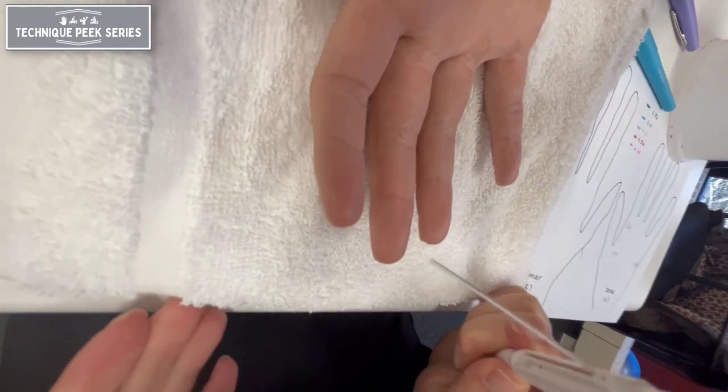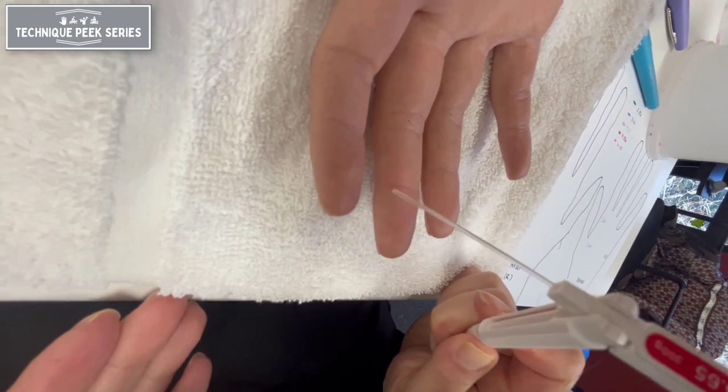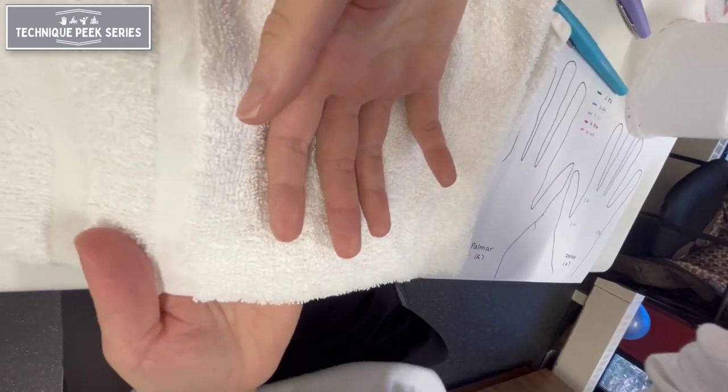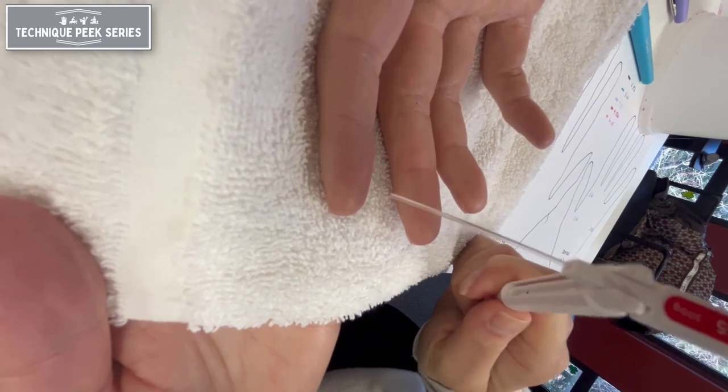The positioning of the patient on a padded surface such as a towel or putty is important to support the fingertips when using the larger monofilaments. As you can see here, when unsupported, the finger is depressed with the monofilament, which can sway the results of the exam.